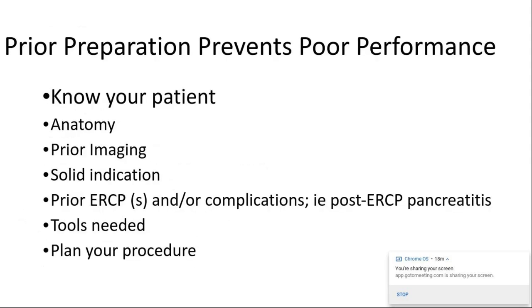So you absolutely have to know your patient. You want to make sure you understand the indication for ERCP and that you have a solid indication for what should now be a mostly therapeutic procedure. You want to make sure to understand the anatomy of your patient, know if they've had surgery, such as any duodenal or stomach procedures, a Whipple, a Billroth, as this will help dictate what scopes you can use and how you're going to sedate this patient.